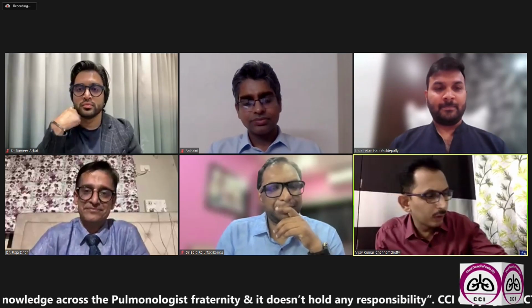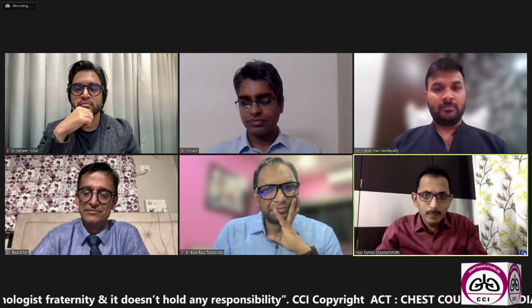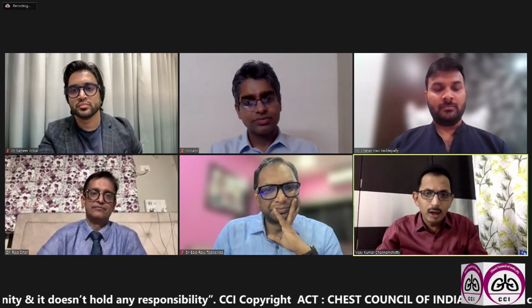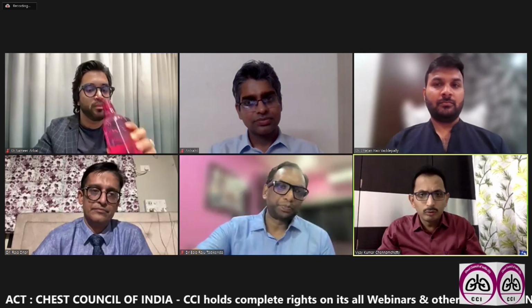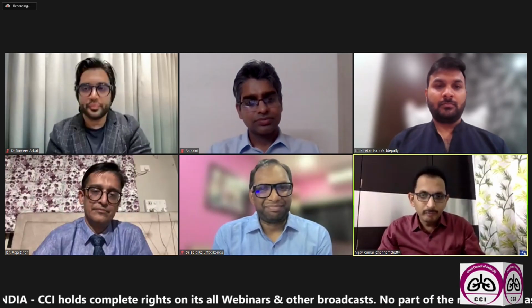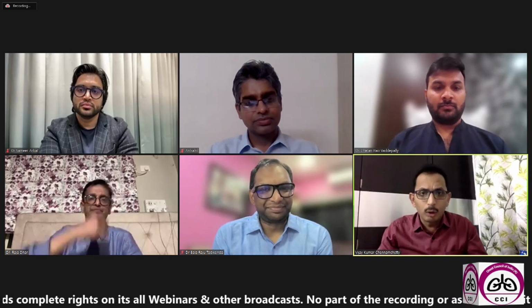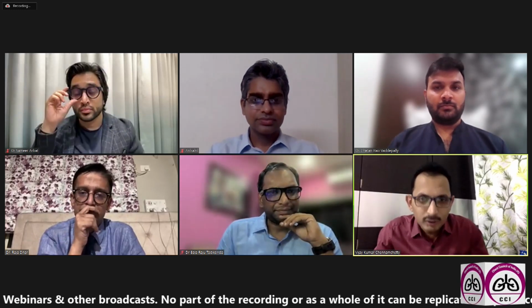Sure. I saw Vijay's hand in passing, but Vijay, did you put your hand up? Yeah, go on. It depends on how we coordinate with our pathologists, because many times our pathologists are also comfortable. Initially, we thought that only 1.9 mm lung biopsy specimens would be ideal, that they can give the diagnosis. But in the past probably 4 to 6 months, we are using quite often 1.1 as well. But to be honest, 1.1 also we are reusing. It is giving a reasonably good amount of tissue, so that our pathologist can arrive at the diagnosis. That's what I want to say.